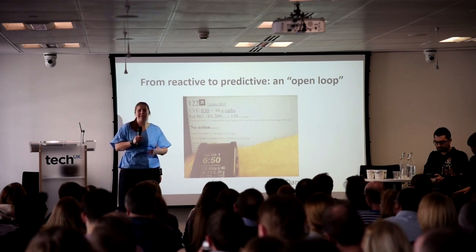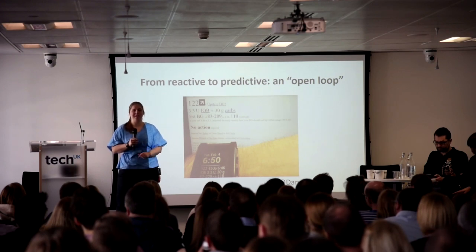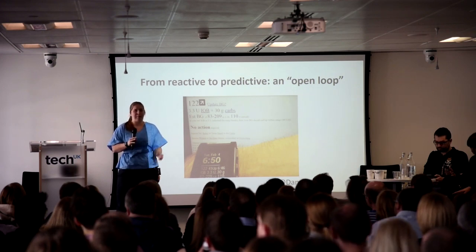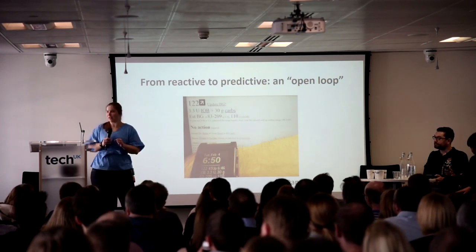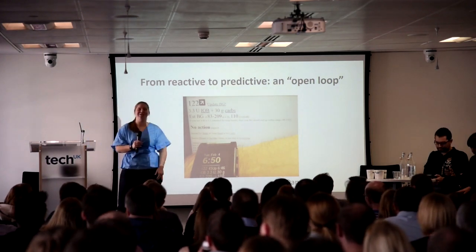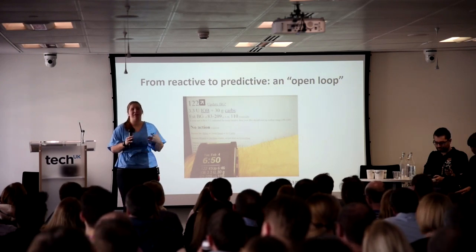But within that same week, I also managed to sleep through the alarms, because it's not just the volume, it's the alert fatigue we people with diabetes get. A couple of us have been twitching all day because everybody's pumps keep vibrating and buzzing, and you're like, okay, is it me? Is it not me? So we get alert fatigue from all of that, and that's something that's not really recognized by the industry. We don't have a lot of solutions for that.